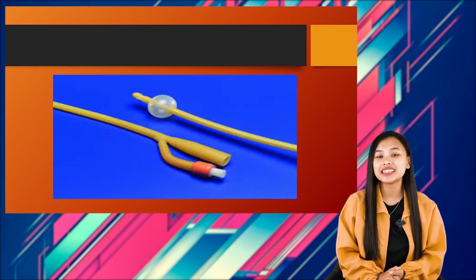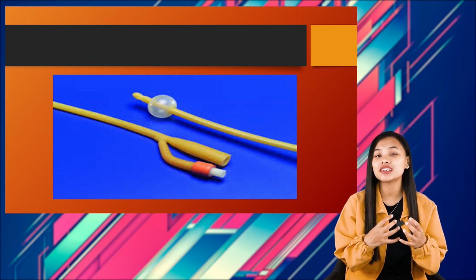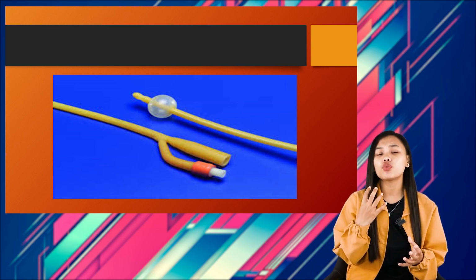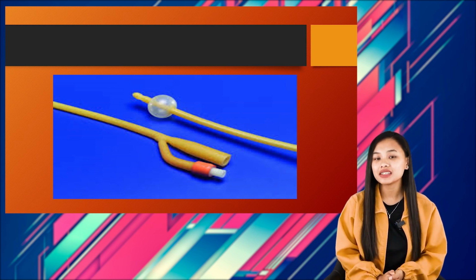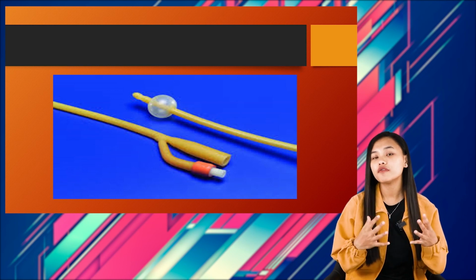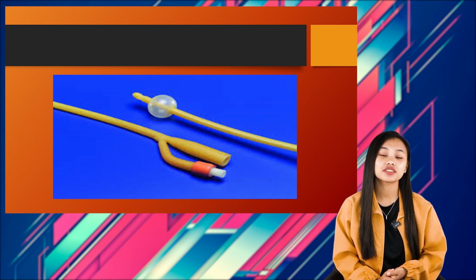As you can see in the picture, this is what an indwelling catheter looks like. You can see that there is a balloon at the tip of the catheter. Why is this present? Once the catheter is inserted into the bladder, this balloon will be inflated, and as it is inflated, it will be larger than the opening of the urethra. In this manner, it will help to retain the catheter in place.